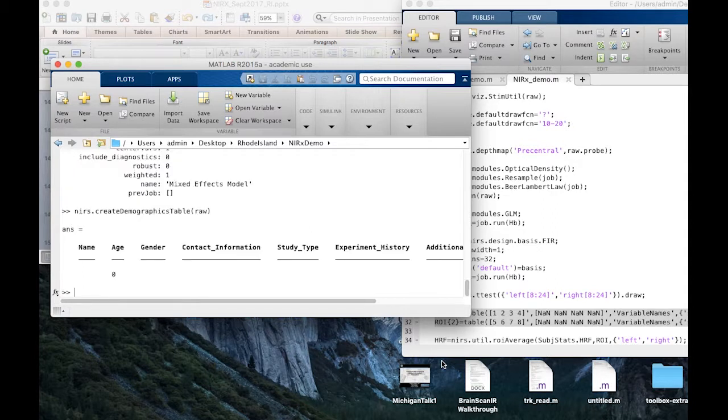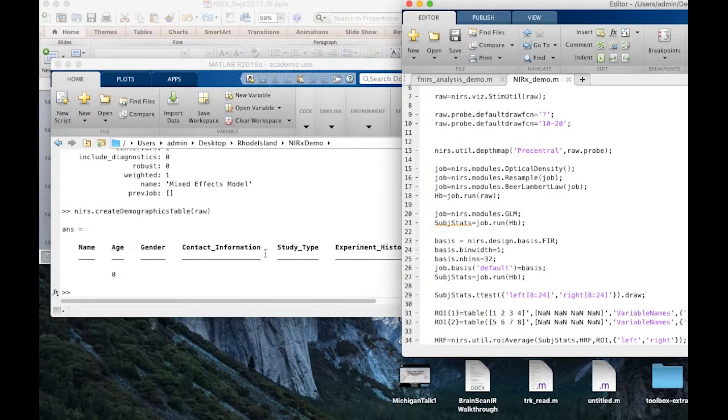when I loaded that data variable, when you save your NIRX data, it went through and asked you what is the subject ID and what is their gender and age. Because it's all in the file, I already have all that information in. This one happened to, Thomas didn't enter any of that information, but if you did, it would all be available. And because age is a variable, I could put it in that model and I could look at, well, did brain activity change with age or gender or whatever. So we can deal with all of that same stuff that you would do in SPSS. We're just able to do it in a more NIRS-specific way.